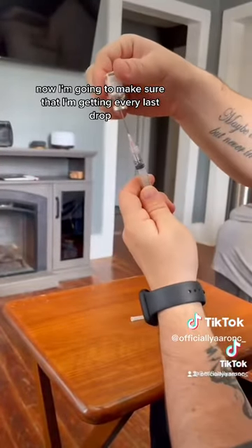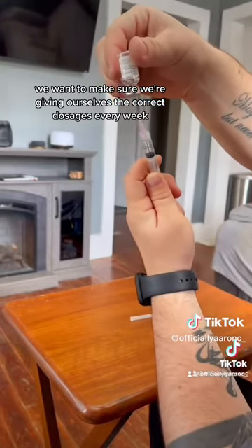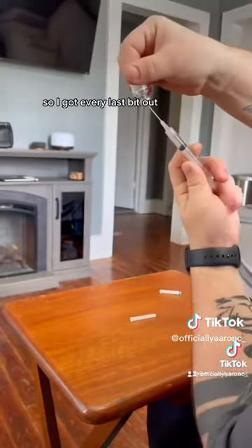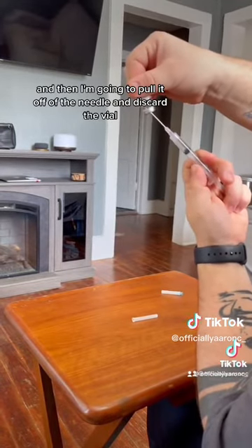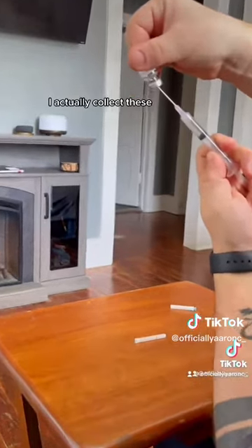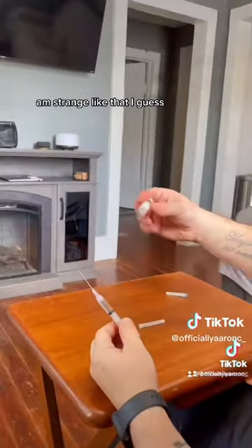Now I'm going to make sure that I'm getting every last drop, because we want to make sure we're giving ourselves the correct dosages every week according to our doctor. I got every last bit out, then I'm going to pull it off the needle and discard the vial. I actually collect these — it's probably a weird thing to say, but I do keep them.